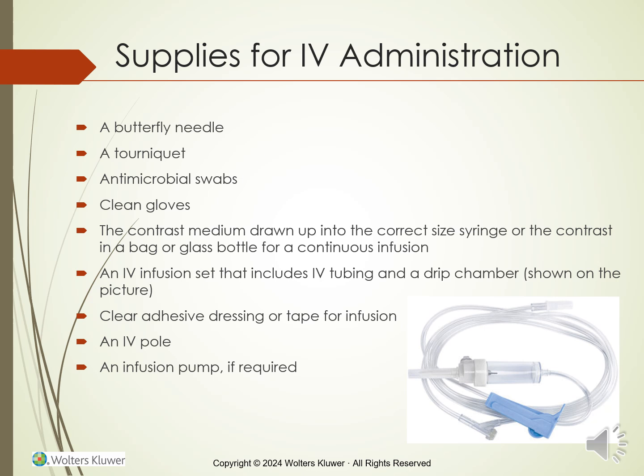The needles can be of various sizes, and you can use a butterfly or an angiocatheter, which is used to start an IV.